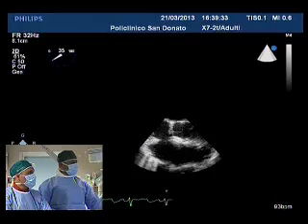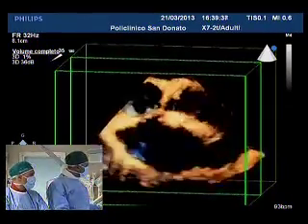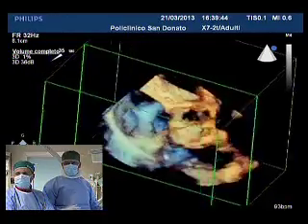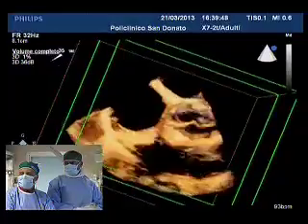He's in normal sinus rhythm. The echo shows actually no AR. Did you see any AR, guys? So the AR got repaired because we closed the VSD, hoping that now we will protect the aortic valve from this Venturi effect and watch the patient.